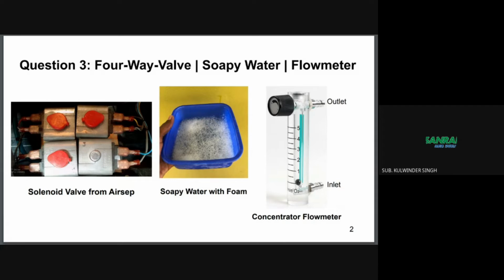Another reason can be a broken or faulty flow meter, which gives room to fluctuations. The broken flow meter allows air to escape and this results in fluctuation. Blockage or obstruction in the intake pathway also causes fluctuation. If any blockage is found, clear it for the best functionality of the machine. Thank you.